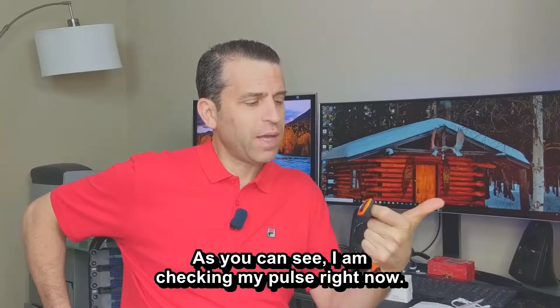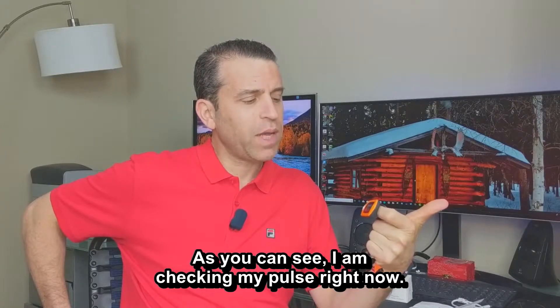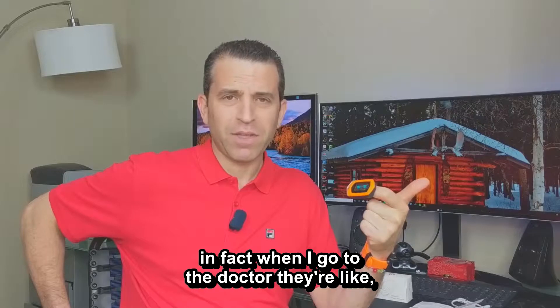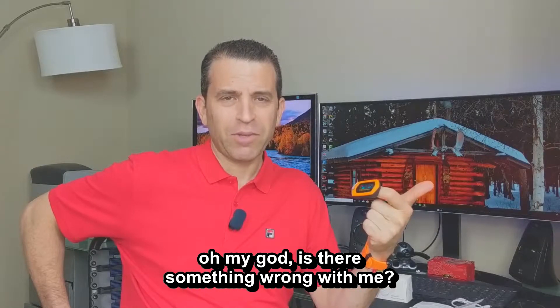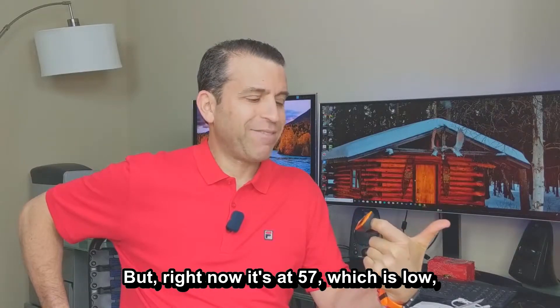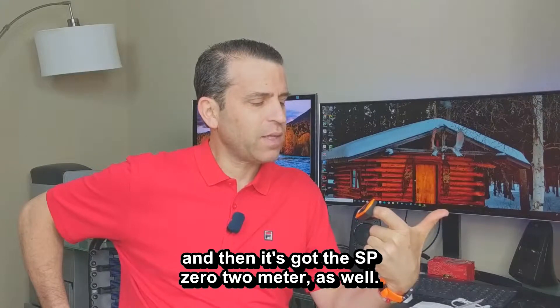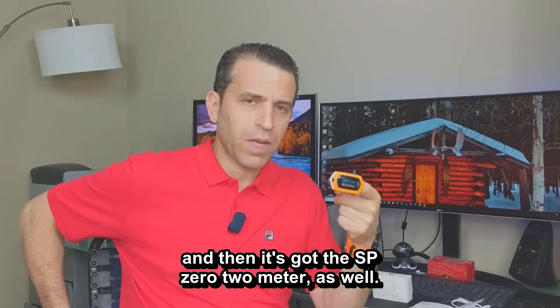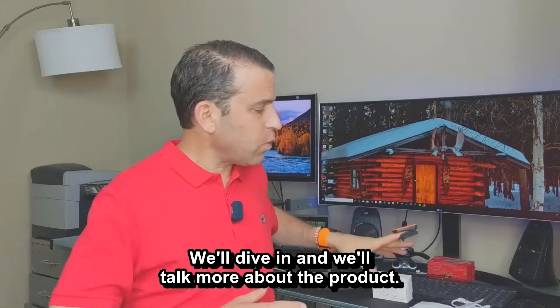As you can see, I am checking my pulse right now. I've got my pulse rate — I have a very low pulse rate. In fact, when I go to the doctor they're like, oh my god, is there something wrong? But right now it's at 57, which is low. And then it's got the SPO2 meter as well.